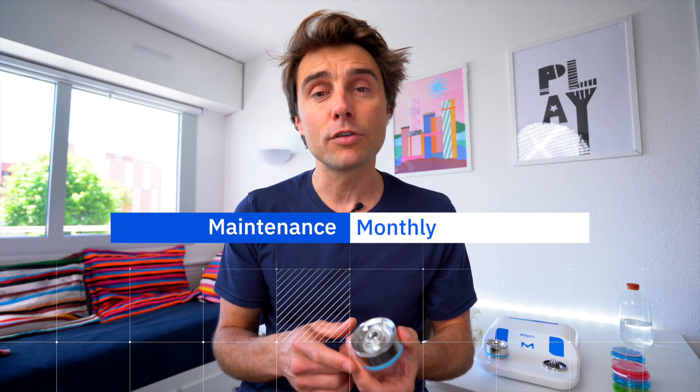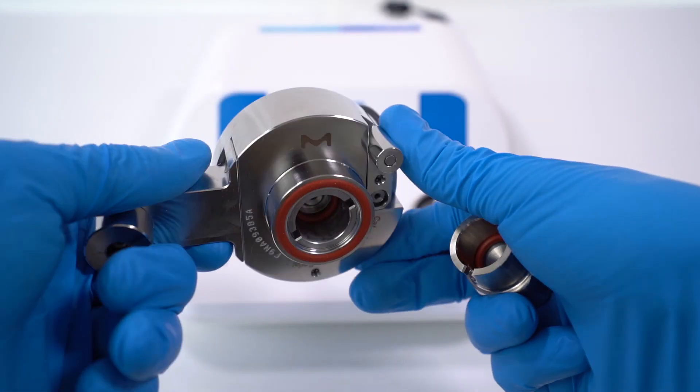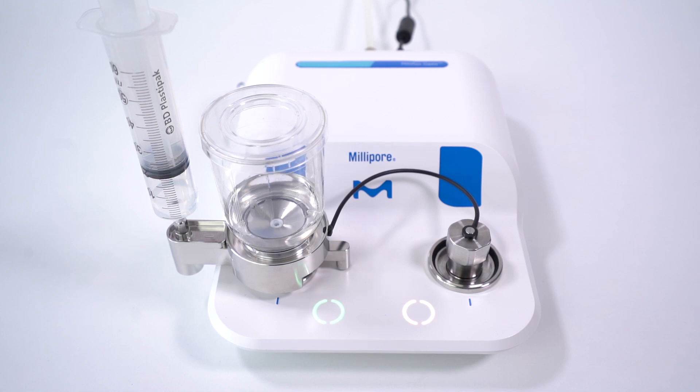The thing I like the most with the system is the maintenance, because you don't have so much to do. You only have to clean the pump and the system before and after your test. Then on a monthly basis, you need to clean inside the pump using a kit. It's already provided with the system and it's really fast. So quite simple — I like it.